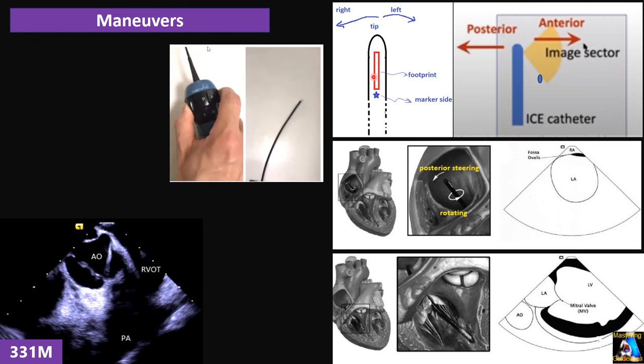In particular, its length, the prominence of the eustachian ridge, presence of hypertrophic pectinate muscles and pouches. These findings help the operator define the best strategy and choose tools to overcome the anatomical challenges.